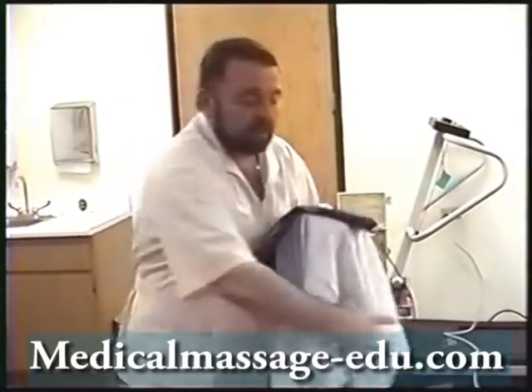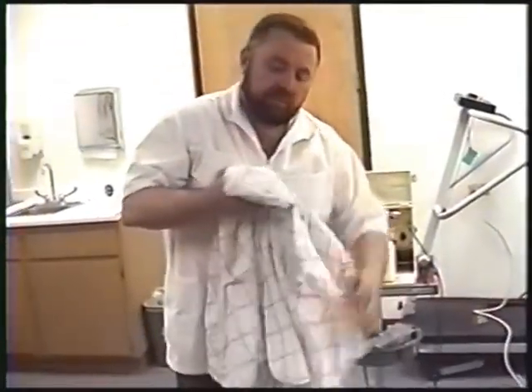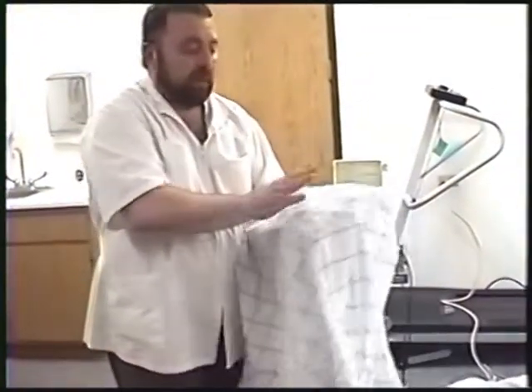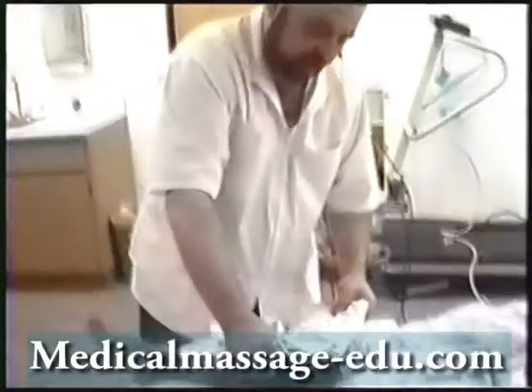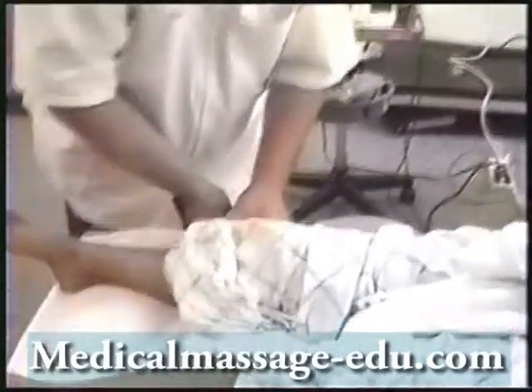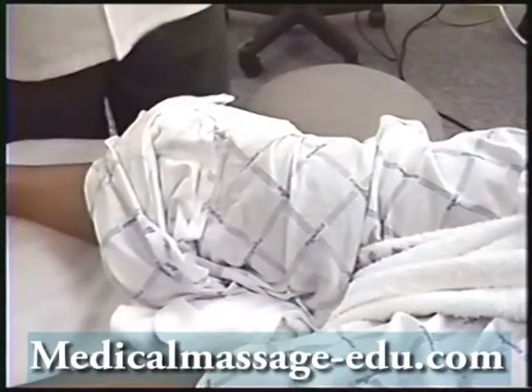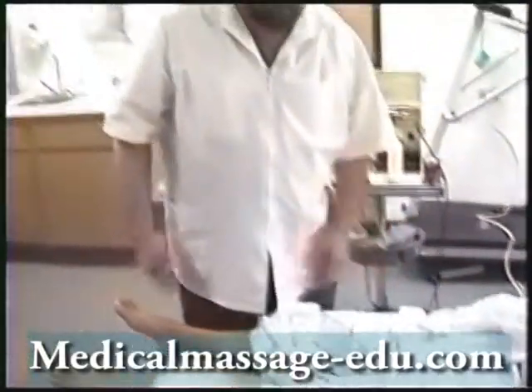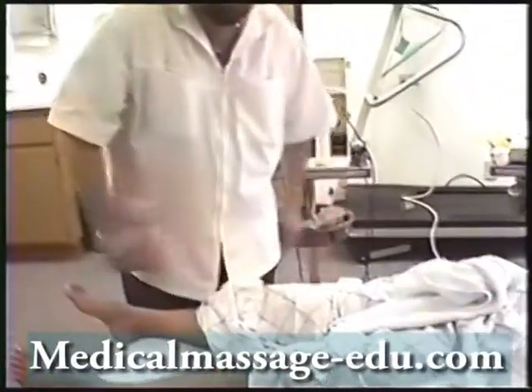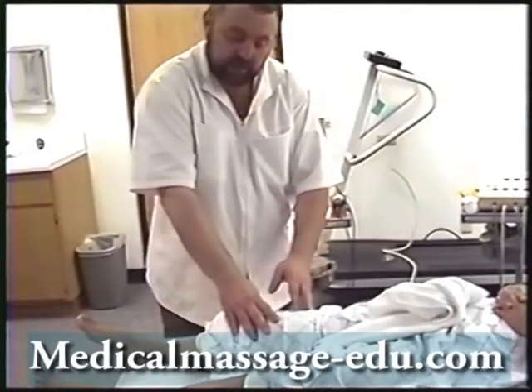Very important: this is not to put it directly on the skin — it must be covered with a towel. In this case, I put a cloth on it and I usually make it a little bit wet. Like this, we place it on the injured area. If it's the lower back, you put it on the lower back; if it's the neck, we have a special cold pack for that. No more than 10 minutes for cold application — 10 minutes is the maximum.